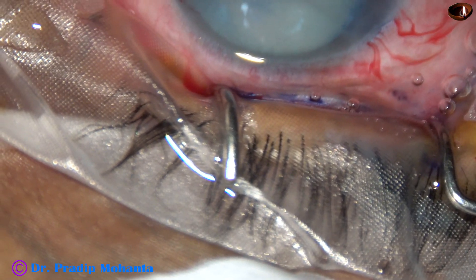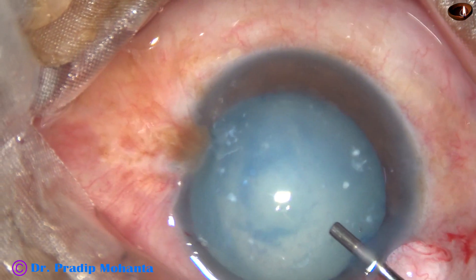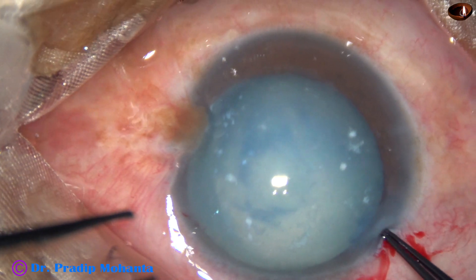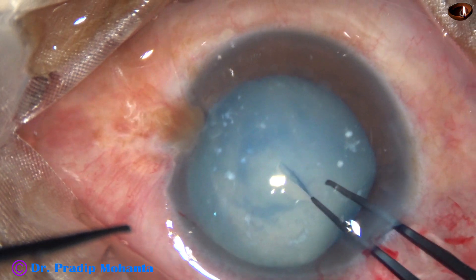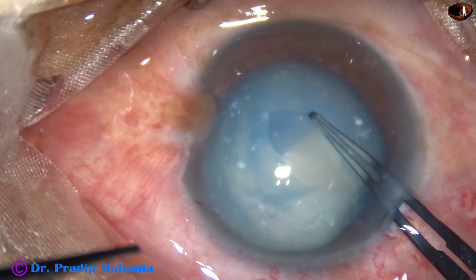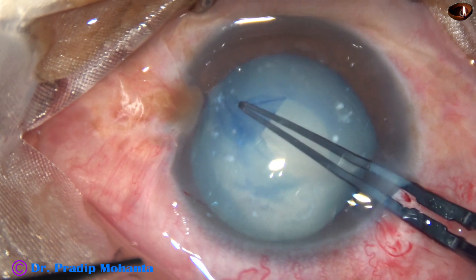Then, 2% HPMC is injected. I take a Utrata forceps, hold the capsular tag with the Utrata forceps, and go anti-clockwise. So far, it is okay. Now, as I go near 6 o'clock, I feel some resistance.